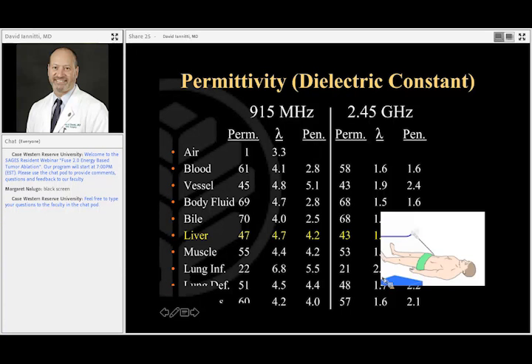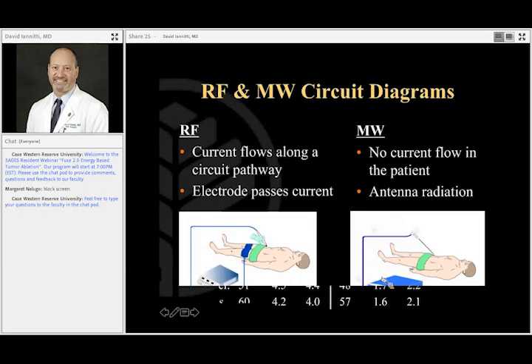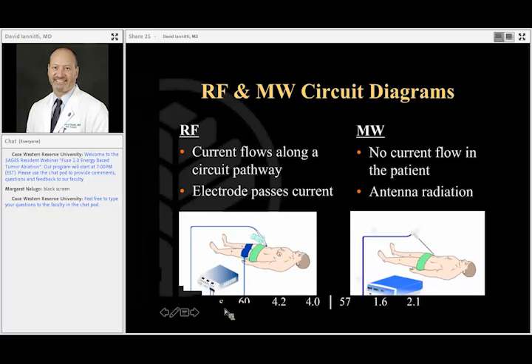So as Dr. Choi was saying, how energy is deposited is completely different between RF and microwave. With radio frequencies, you have a radio frequency generator, and basically you're passing electric current through the patient to the grounding pad and back. And so you have high current concentration at the needle point, and you diffuse that energy concentration with multiple grounding pads. With microwave ablation, there is no electric current being passed through the patient. You're placing an antenna into tissue, and then you're applying energy, and that energy is deposited into the tissue, not with electric current, but with waves.